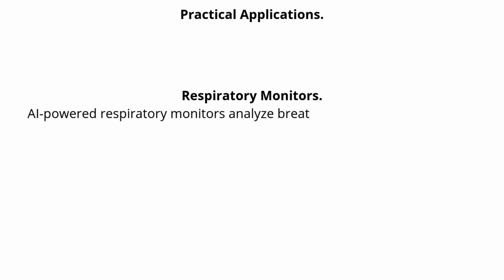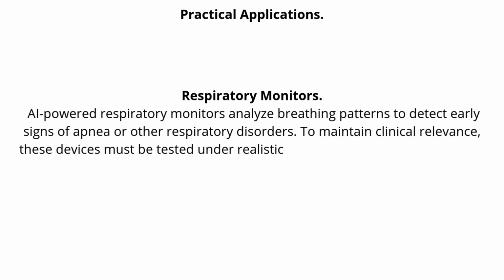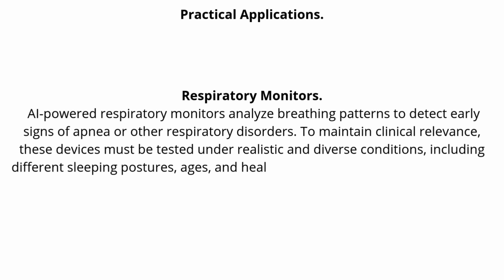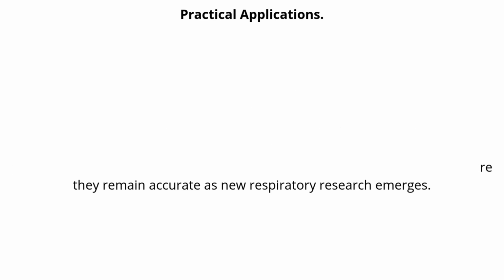Respiratory monitors. AI-powered respiratory monitors analyze breathing patterns to detect early signs of apnea or other respiratory disorders. To maintain clinical relevance, these devices must be tested under realistic and diverse conditions, including different sleeping postures, ages, and health states. Continuous updates ensure they remain accurate as new respiratory research emerges.